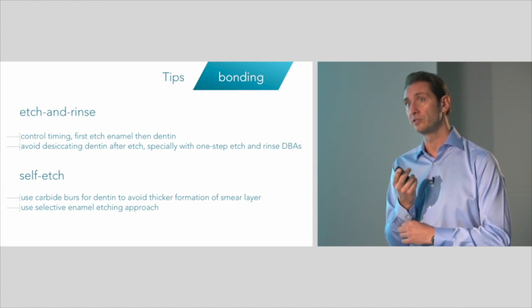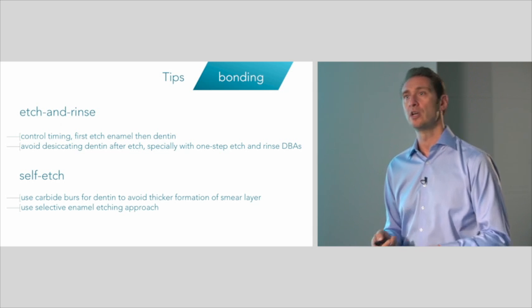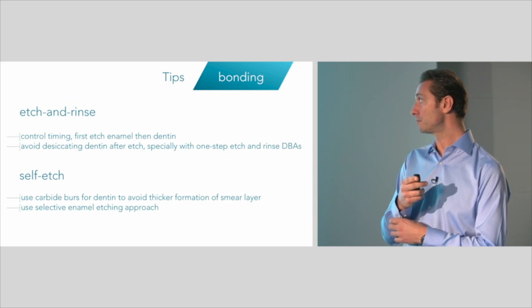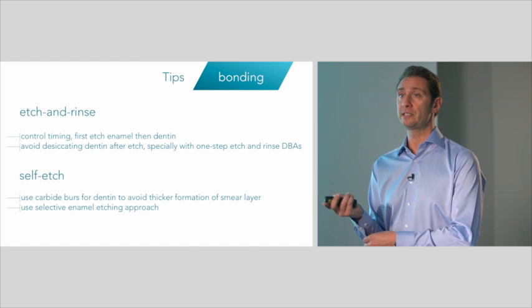It's very critical to be sure that you're not desiccating dentine. You need to have a substrate that is ready to absorb all those bonding agents.